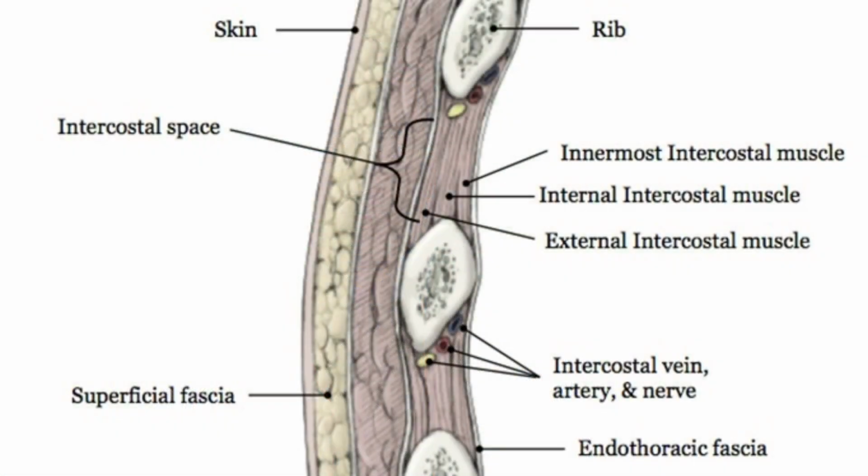So now a thoracostomy tube is usually placed between the mid to anterior axillary line in the 4th or 5th intercostal space. You need to be aware of where to track the needle, above or below the rib. So remember, you need to track the needle above the ribs, so you do not injure the intercostal bundle.